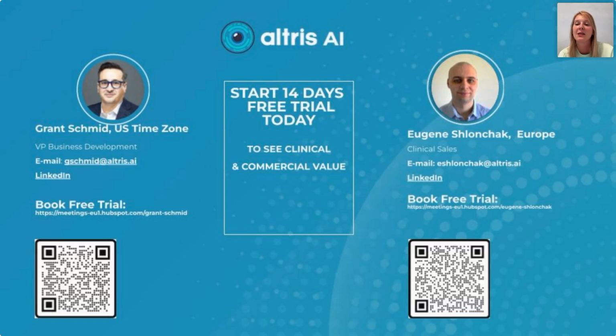Where your servers are based. Our servers are based all over the world. This is basically the question about data security. We know that healthcare data is very sensitive, and there is a high demand for location of services in different parts of the world.